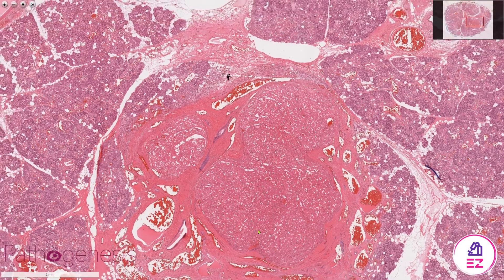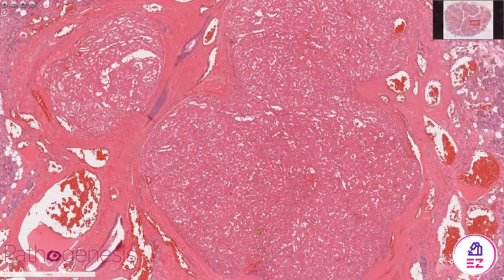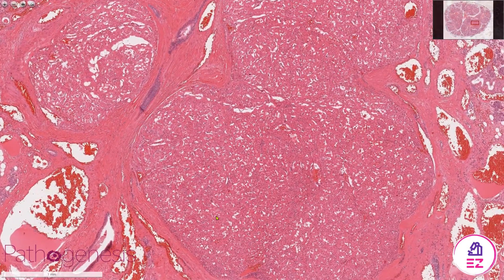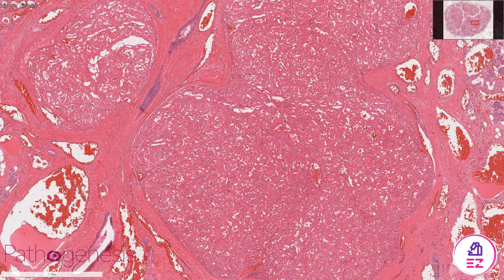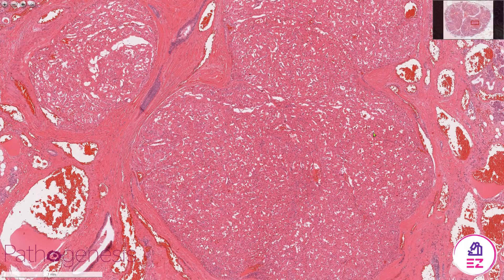Immunohistochemistry isn't really required to make this diagnosis, but as you'd expect these cells will be positive for things like PTAH, because they're oncocytes, and also some epithelial markers; however, myoepithelial markers would typically be negative.